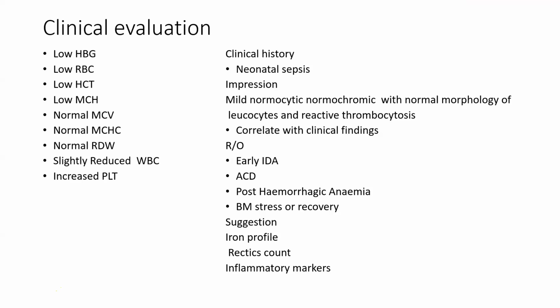In the aspect of the CRP and the inflammation markers, supposing you do the CRP and the marker you are getting is not correlating to what the machine gives you, there's one way or the other to look at your sample very well, and then you do your quality check and quality control before you rule out some few things. It's just an add-up that I wanted to add to what you said.